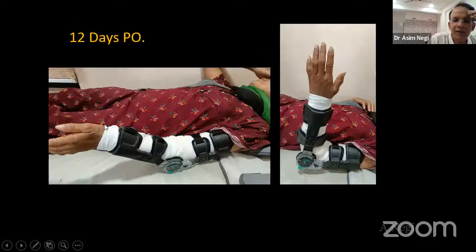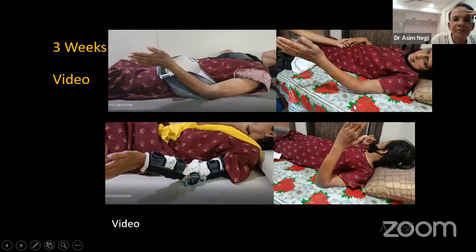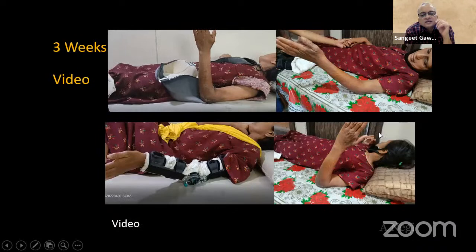This is the hinge brace. You can fix the angles. 12 days. 3 weeks. Don't allow a complete extension. Initially, you can prevent it at 30.